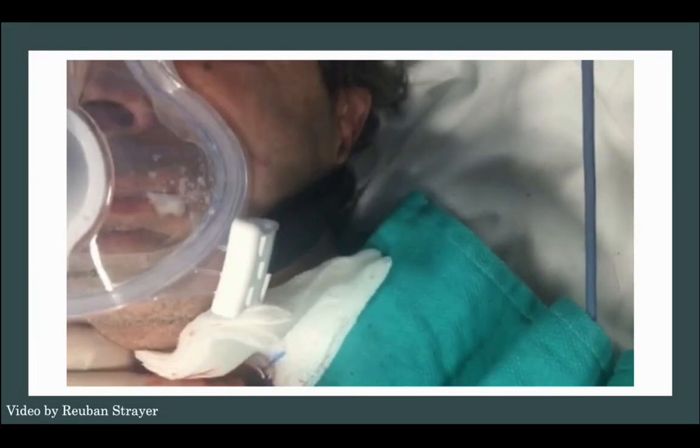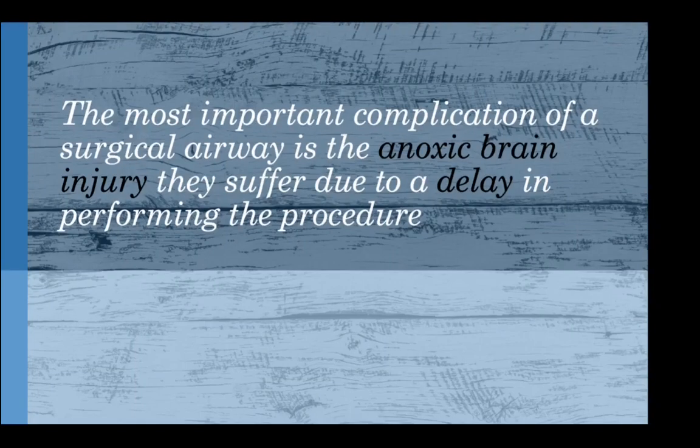So this is a great video to show you anatomy and show you when a patient is breathing. Obviously they did an awesome job here because this was a successful crike. But there are a couple of things to learn here: keeping that hand anchored, and making sure that you dilate with your finger. Also, you probably don't need lube because you're going to have some physiologic lube.